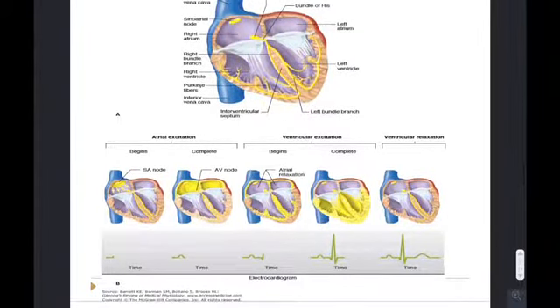We will start from here. Atrial excitation begins with the SA node until it reaches the AV node, forming the P wave. And as I said before, no contraction occurs here, but it is fully excited. After the PR interval finishes, it empties the blood into the ventricle.